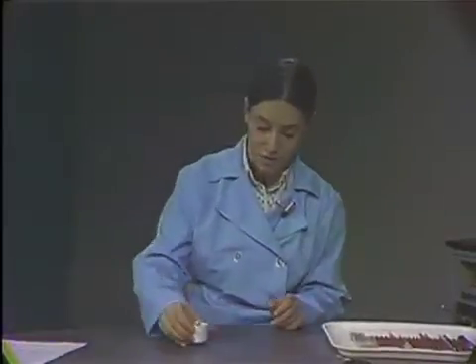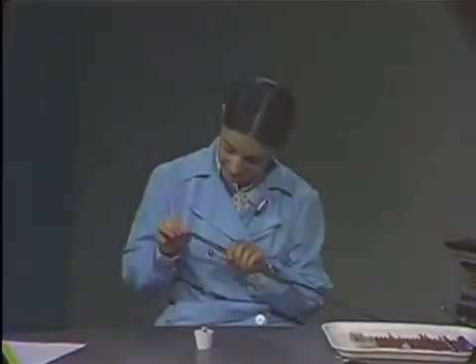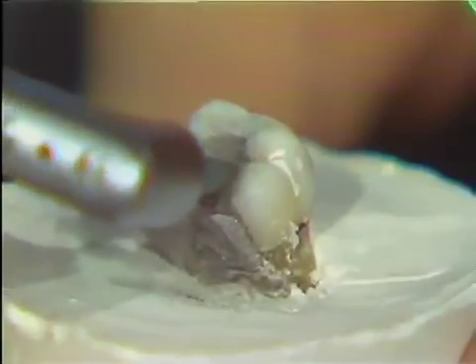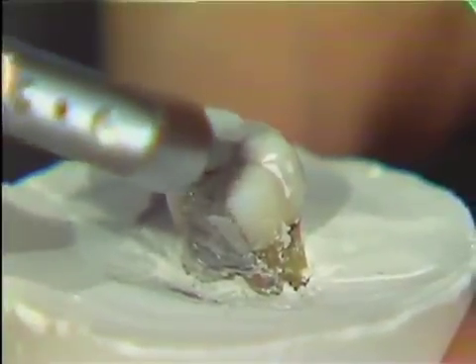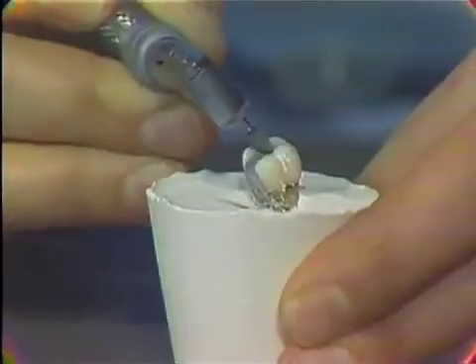From talking about interproximal surfaces, let's move to the polish of occlusal surfaces. When you remove gross amalgam of any kind on the buccal, lingual, or occlusal surfaces, you will be using your green stone. There are several shapes of green stones; we will be using the carrot shape. Use only the tip of the green stone and use light intermittent pressure with a high rotational speed. This particular stone won't do you any good working in small defined areas such as working on the anatomy, but it removes a lot of amalgam and is used in situations of gross deposits.